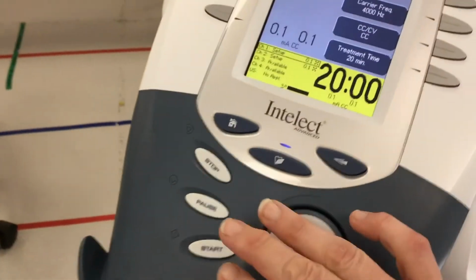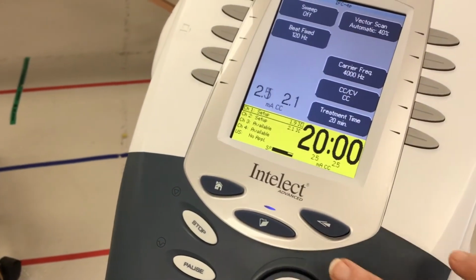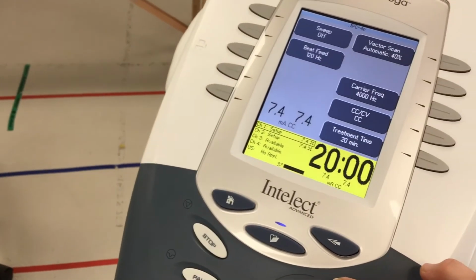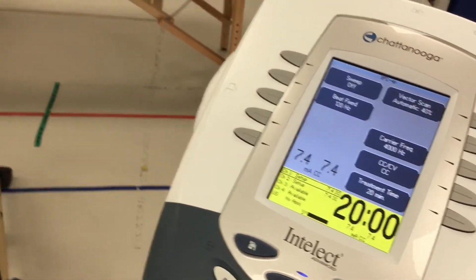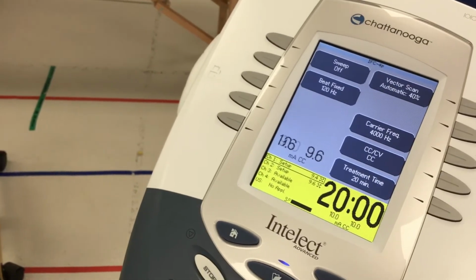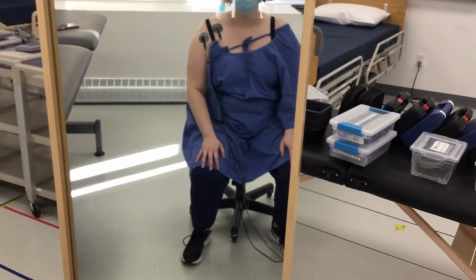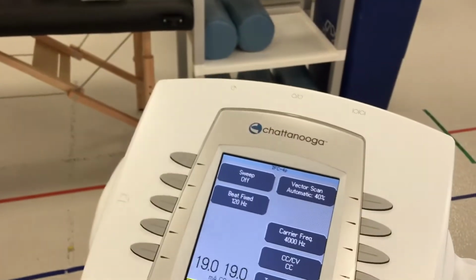All right, so then we can come here and start to turn it up. We know from experience that she won't even feel it until we're up to at least 5. So let's go fairly quick up to 5. Layla, let me know when you start to feel it. "I'm starting to, but it's very weak." Okay, so now instead of asking her, is that enough, I want her to say, I want you to have a fairly strong feeling, but it should still be comfortable. Tell me, is it still comfortable? "Yes." Are you getting a longer, bigger feeling? "Oh, yes." Is it beginning to be less comfortable? We could go more. "Oh, okay, that's about the limit." Okay, so here we are.